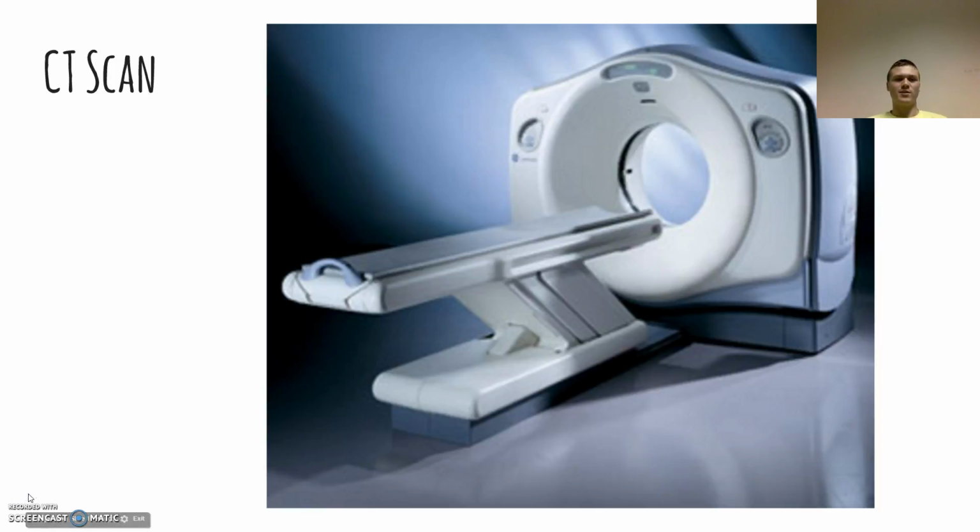Okay, so here we have a CT scan machine, otherwise known as a CAT scan. As you can see, it's a pretty similar setup to an MRI machine. With a CAT scan, the patient lays on the table, which then moves through the donut throughout the procedure.